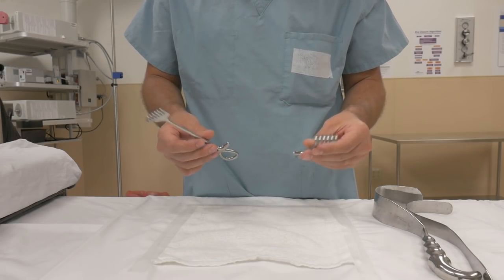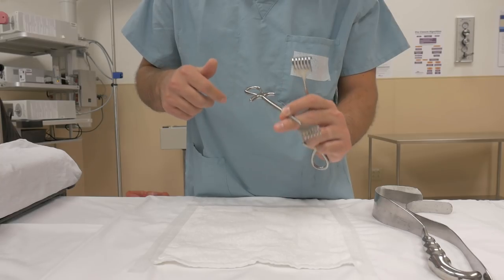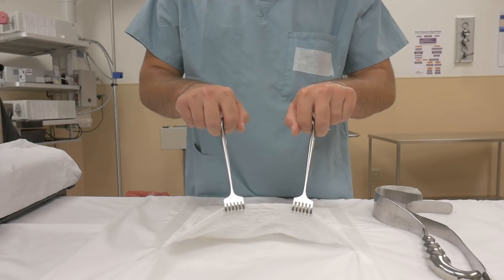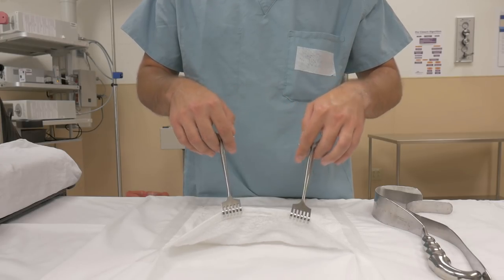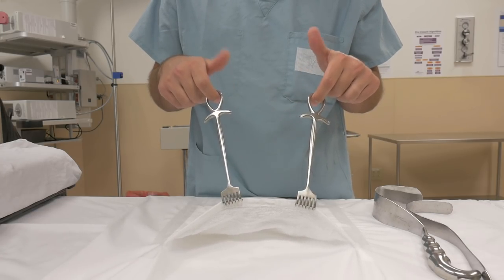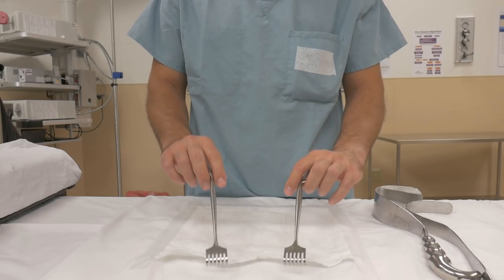Rake retractors are interesting. You've got this nice little T-hook here as well as these nice little oval holes that you can also grip on. Think of it like this — you have your rakes in place and you're holding up a flap of skin for them to undermine the tissue. If you get a little tired and fatigued from doing this, you can switch your fingers over and just have your fingers resting inside the loops. You can also just go full down — you can move your hands all over this retractor.